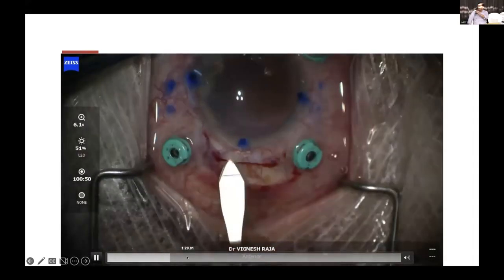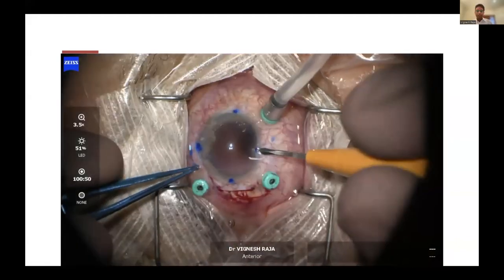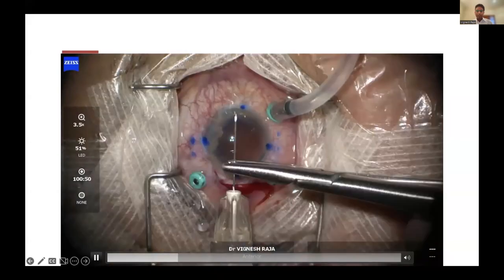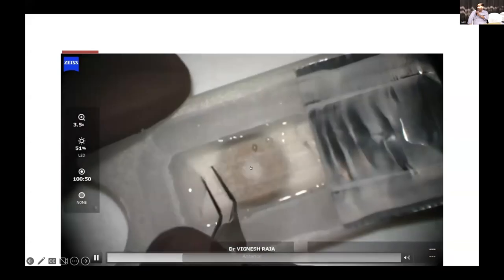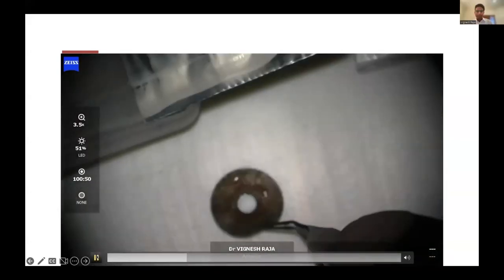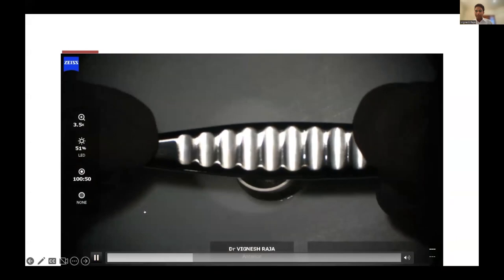The Yamane marking is 2 millimeters, is it not? 2 millimeters behind? Yeah, so both of these are 2 millimeters and 2 millimeters. So I'm now bending the needle. This is a 30 gauge needle? 30 gauge TSK needle from Japan. So this is a custom made iris prosthesis. It's made according to the other eye.